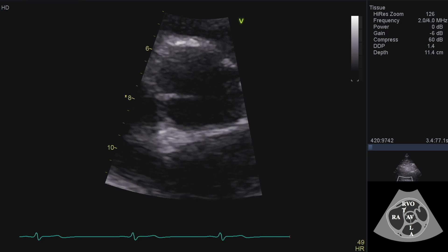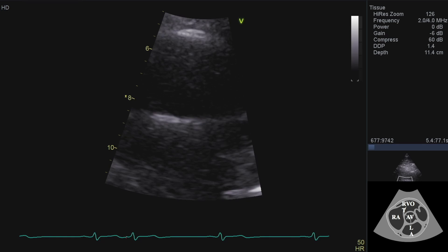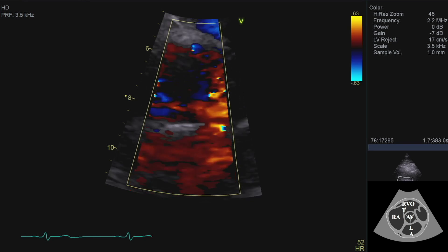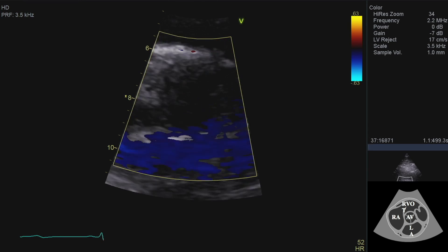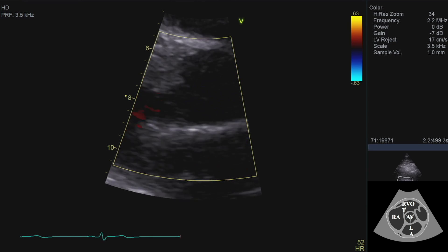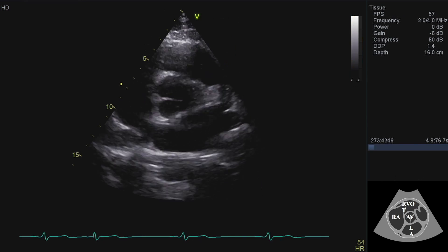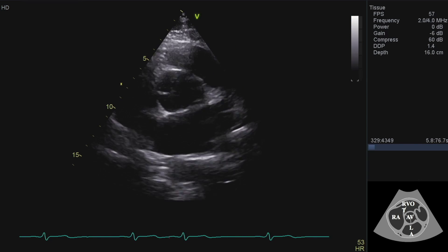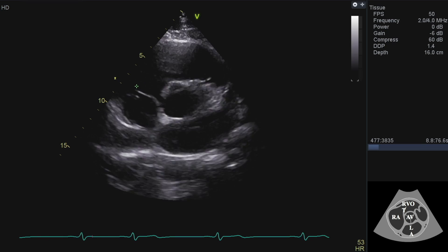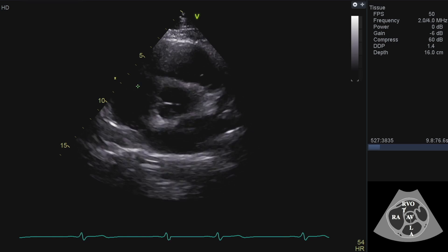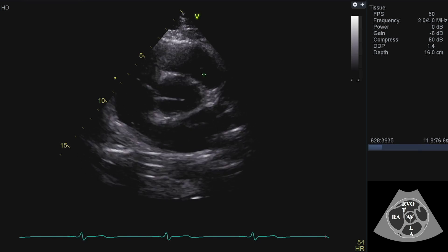I'll put some colour here just to see whether there's any aortic regurgitation — I didn't see any in the other view and I can't see any here either. The other valves visible in this view are the tricuspid valve over here and the pulmonary valve over here.